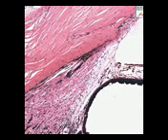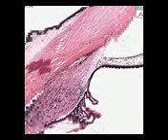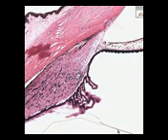And that consists of the choroid within the globe, the ciliary body and ciliary processes in this area near the limbus, and then the iris anteriorly. This is the ciliary body. These are ciliary processes. They contain these small little zonular fibers, which are like tiny tendons, that help flatten the lens, and they pull by virtue of these smooth muscle fibers in the ciliary body.